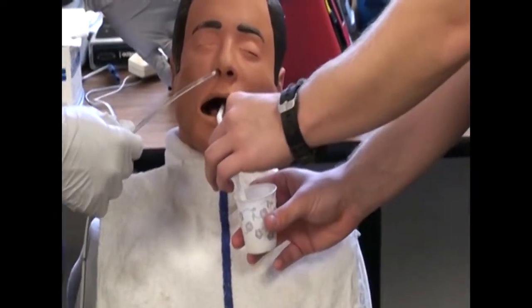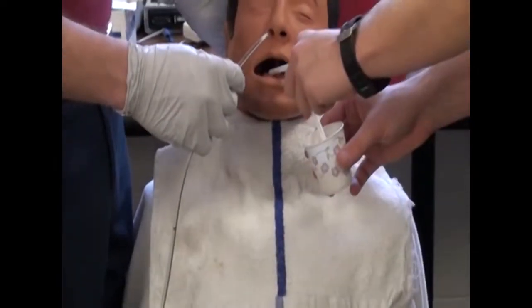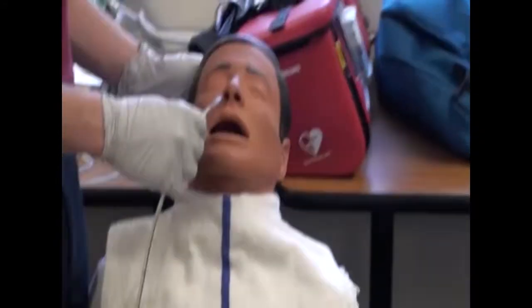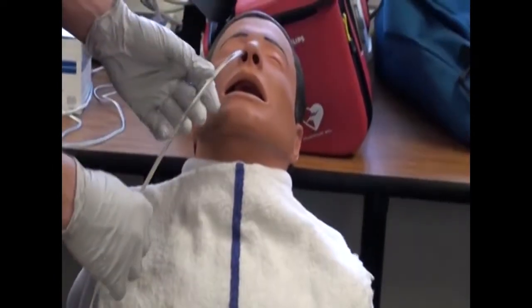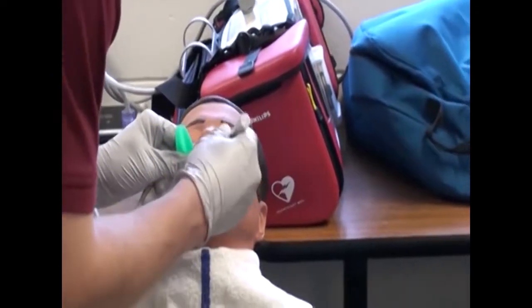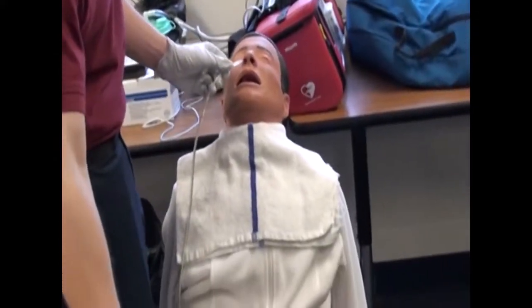If client has trouble swallowing, offer a glass of water with each advancement of tube. If client begins to cough, gag, or choke, stop tube advancement and instruct client to breathe. If coughing continues, pull tube back slightly. If gagging continues, check back of pharynx using flashlight and tongue blade. After client relaxes, advance tube to desired distance.